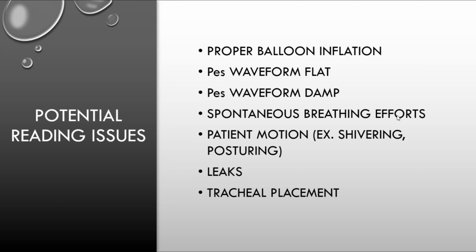And then also spontaneous breathing efforts from the patient, patient motion such as shivering or posturing, which we see a lot in our neuro patients, any leaks in the balloon itself but also in the ventilator circuit, or if your patient has something like a chest tube. And then definitely tracheal placement.